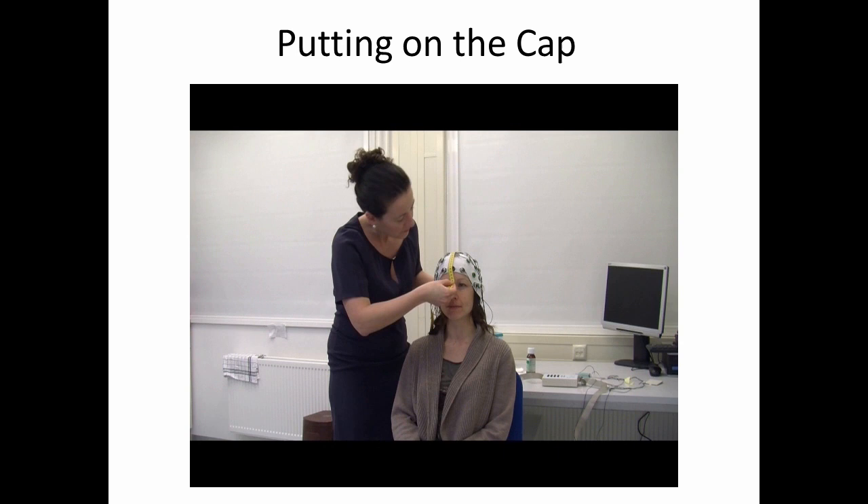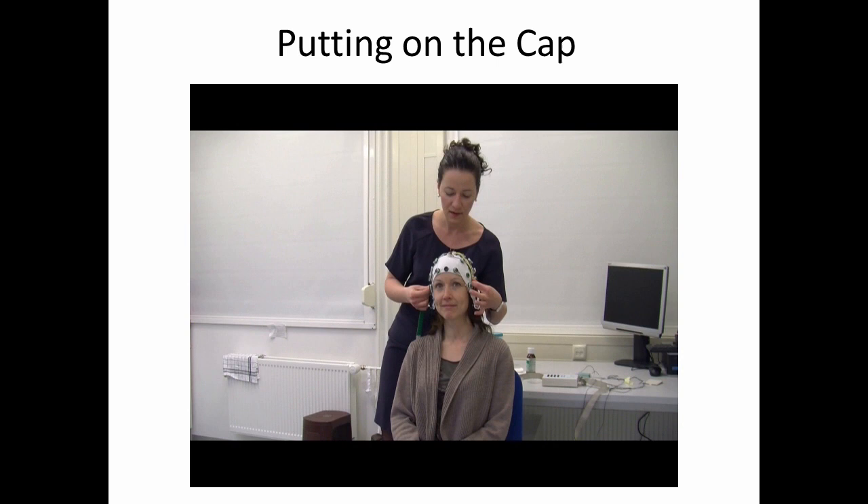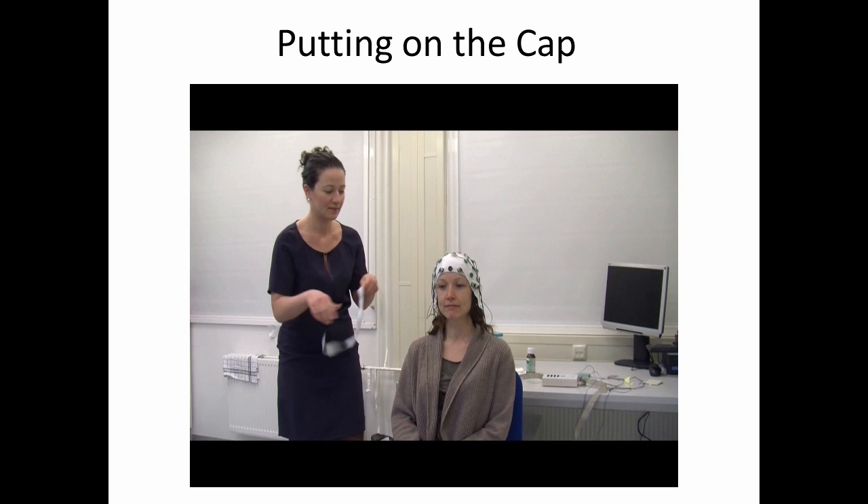One thing you can see here is that putting on the cap is an iterative process where we measure, adjust the cap, and then measure again to make sure that we're centered. Again, the major goal here is to make sure that everybody's electrode cap is on the same relative place of their head.